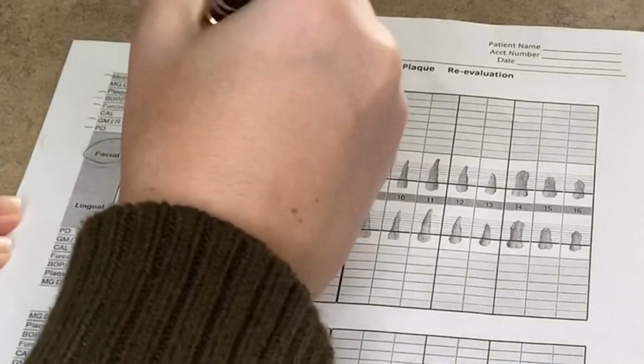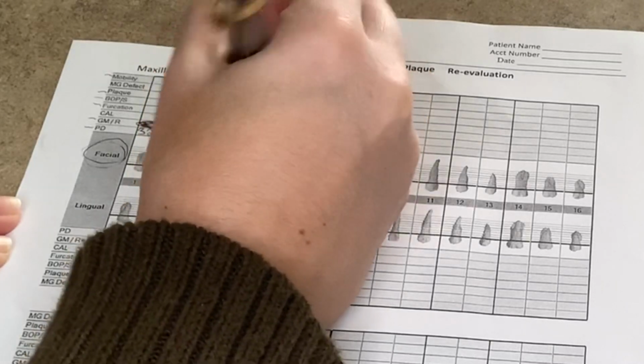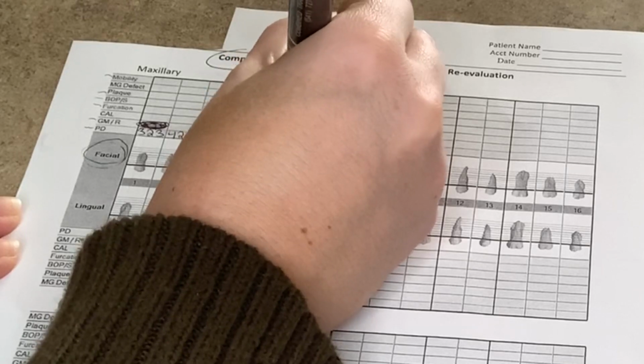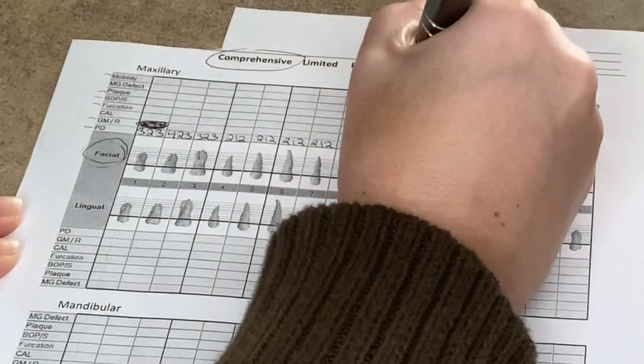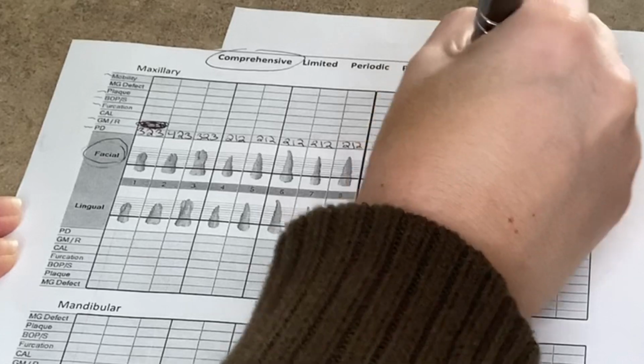So here I'm just showing you how you would write the numbers or type them in on the computer. So as you're writing or typing these numbers, the hygienist is going through and she's saying like 323, 423, 323, 212, 212, 212, 212 as you're typing and writing.